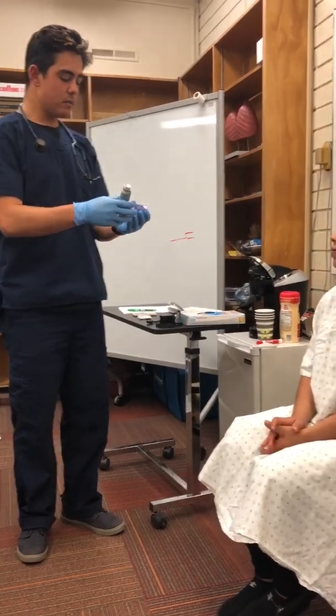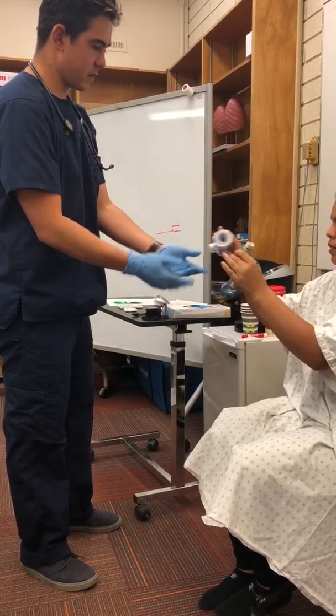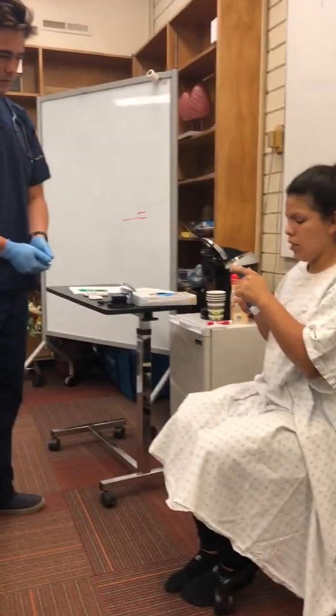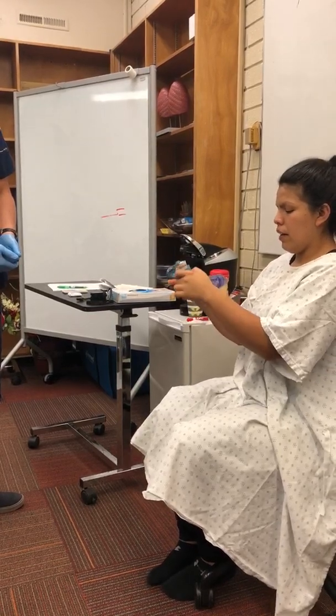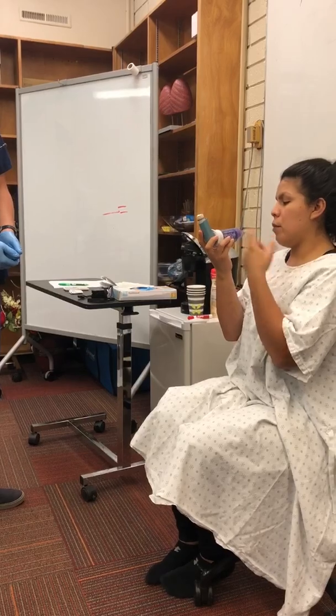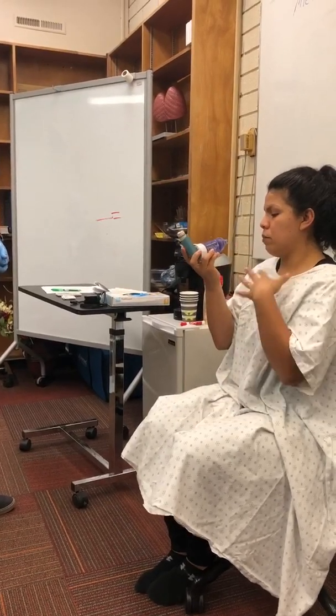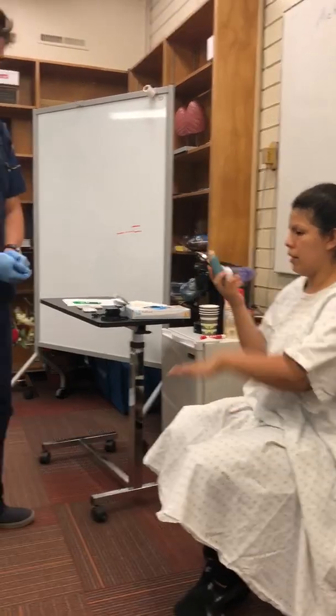No. Okay. Would you mind setting it up for me and walking me through the process before we take it to confirm your understanding? Okay, so I'm going to put this here, and then I want to press it, and then I'm going to exhale out, and then inhale in, and then I'm going to hold it. I want a deep, slow breath. I'm going to hold it for 4 to 10 seconds, and then exhale.